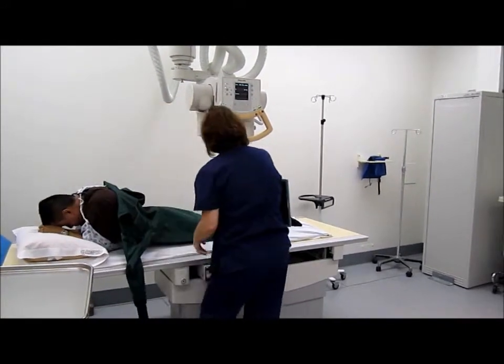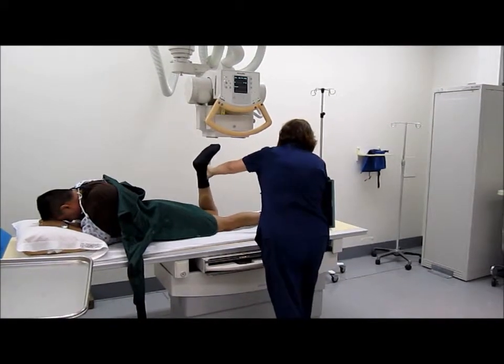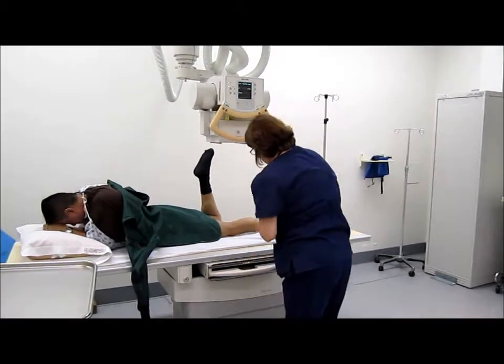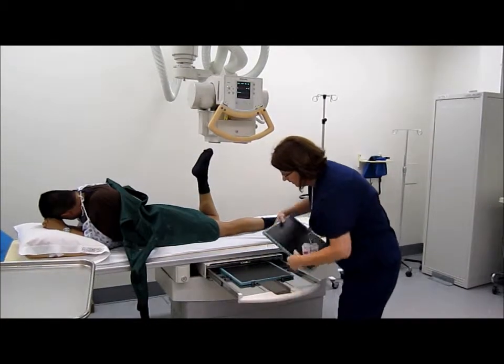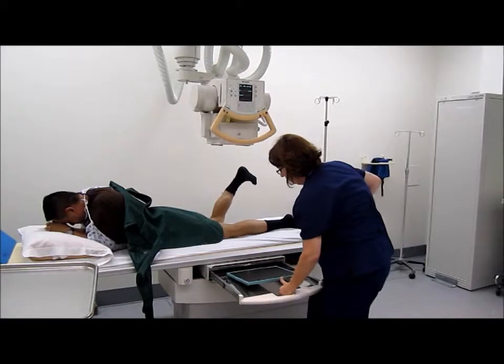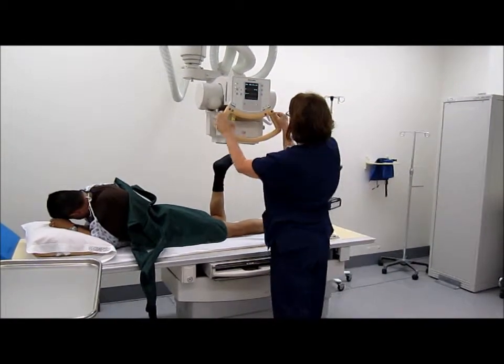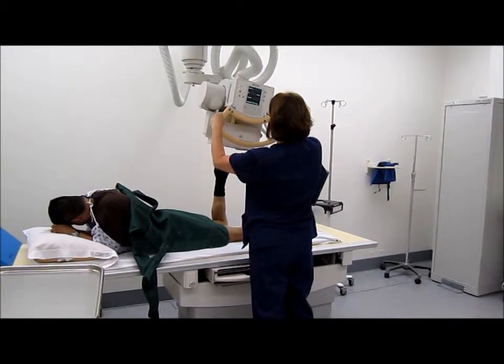And then I need you to lift your right leg up as far back as you can comfortably. I'm going to angle my tube 12 degrees.